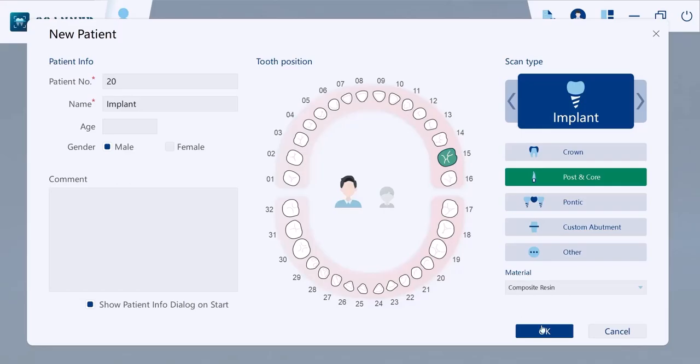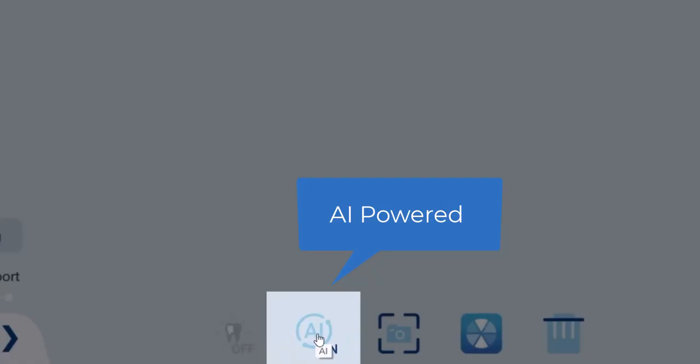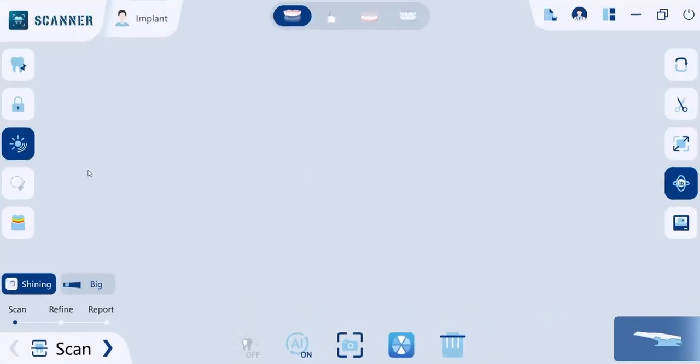Before you start scanning, here are some features to explore. Our software is powered with AI to remove unnecessary data like tongue and cheeks — just make sure that it's turned on before scanning.